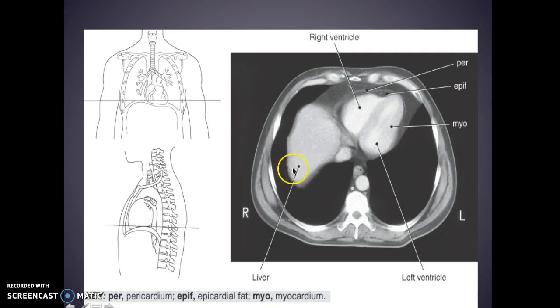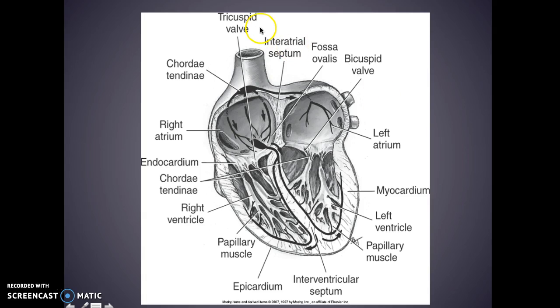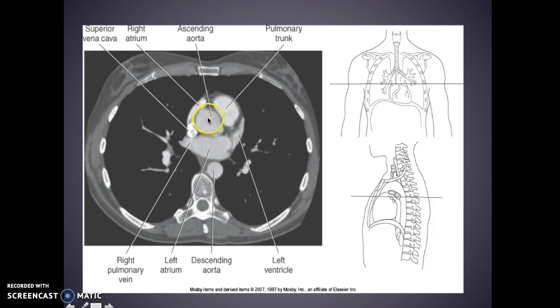Here's the heart — this is the liver. This is the right ventricle and then you can see the left ventricle. This is the myocardium, which is the muscle, and then you can see the fat within there. Coming down: you have your tricuspid valve, your interatrial septum, your bicuspid valve, your left atrium, your myocardium, and your papillary muscles — these little hair-like muscles. You have your interventricular septum, here's your epicardium on the outside, and this is your right ventricle with your right atrium.